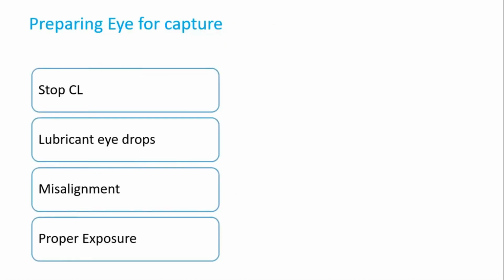So now, while preparing the eye for Pentacam capture, make sure that the patient is seated comfortably, and the patient should have a good eye exposure and avoid misalignment of the head. And make sure to ask the patient about the contact lens history and use. And if the patient has dry eye while examining under slit lamp, make sure that you put a lubricant eye drop before capturing the eye.